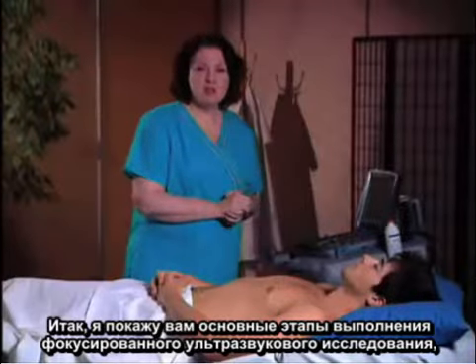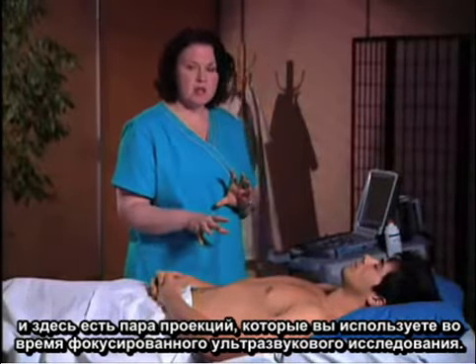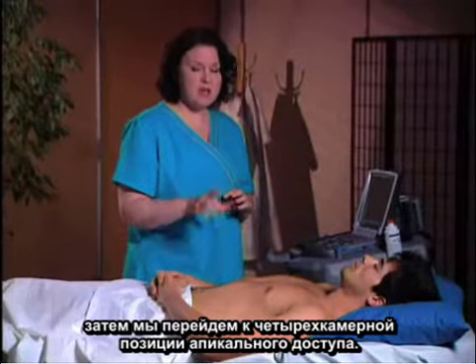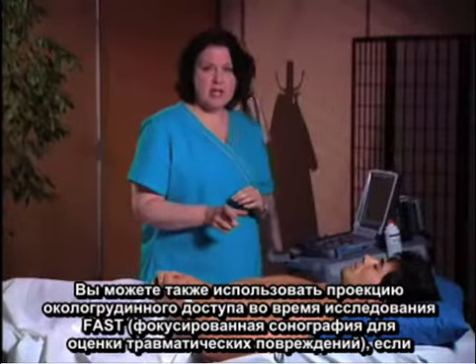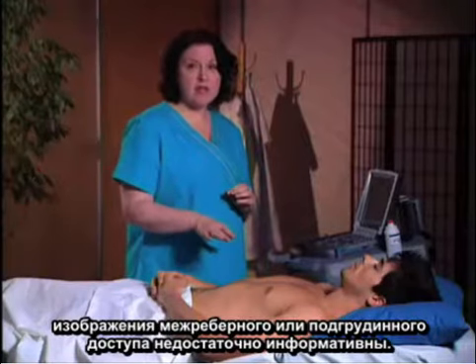Okay, I'm going to walk you through the steps of doing a focused echo exam, and there's a couple of different views that you do as part of the focused echo exam. I'm going to concentrate first on the parasternal long axis, and then we'll walk you through the apical four-chamber view as well.